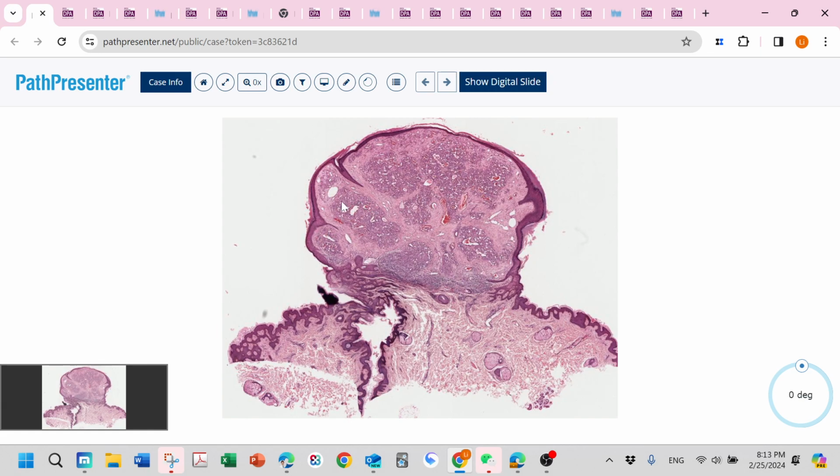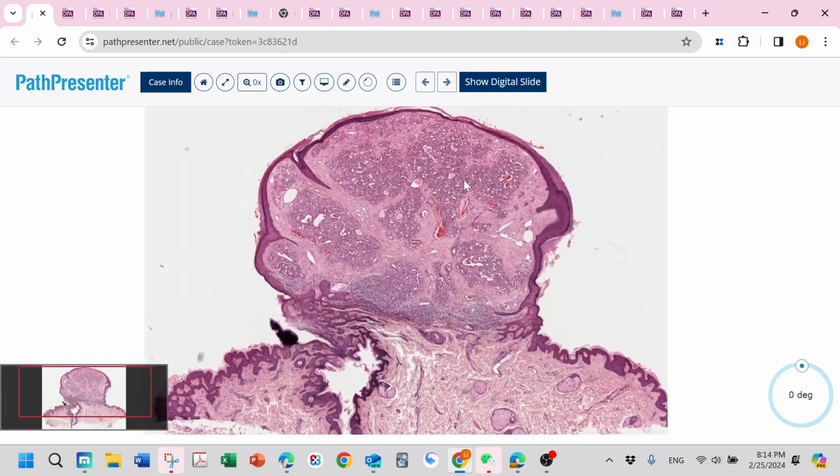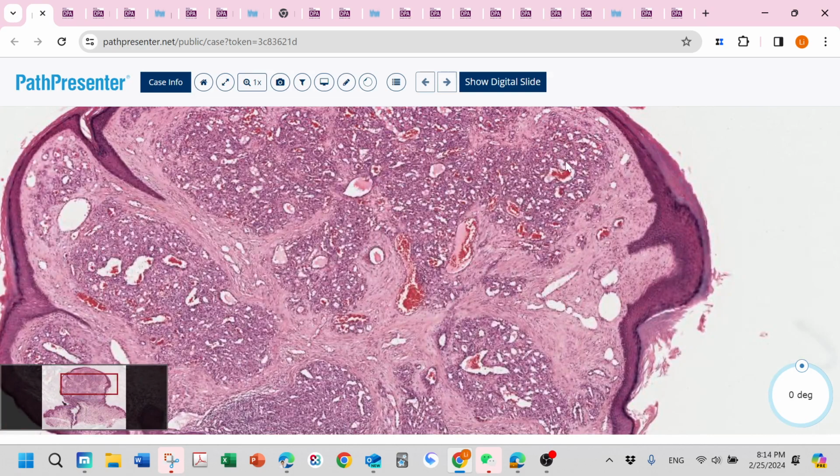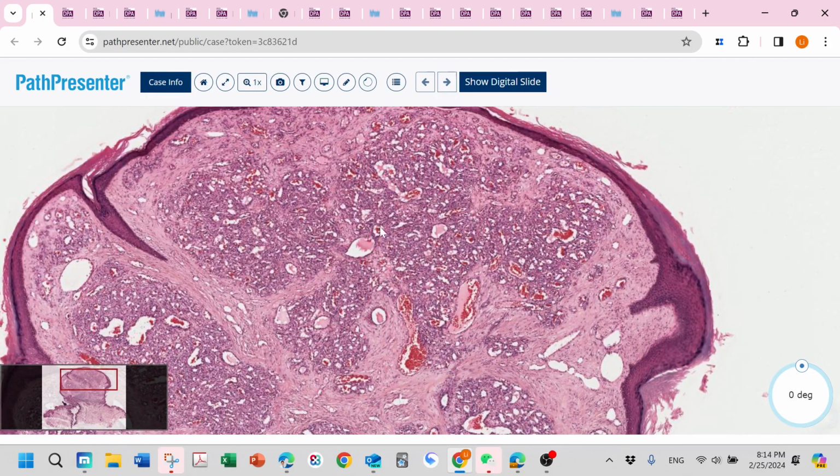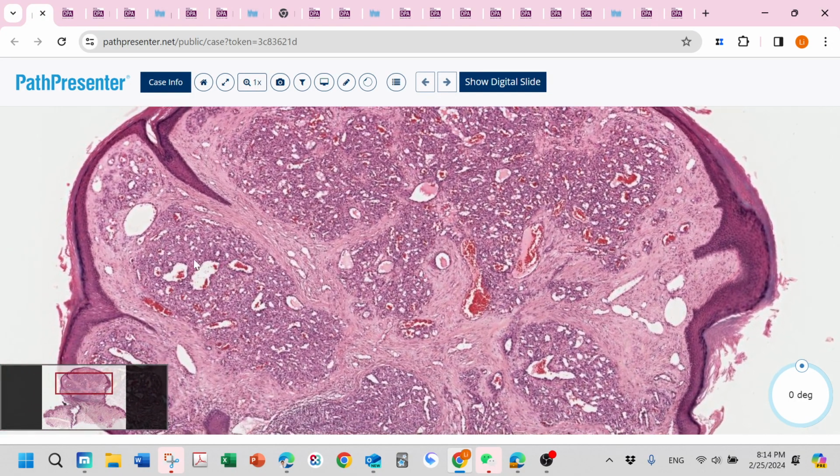Lobular, all of these endothelial cells, this vessel forming lobular, 1 lobular, 2 lobular, 3 lobular. Then capillary means most of the vessels should be small, thin-walled vessels, and usually you will see one big vessel and then a lot of small vessels around it. Big vessel, small vessels around, forming this lobular. This one also again, big vessel, small vessels around.